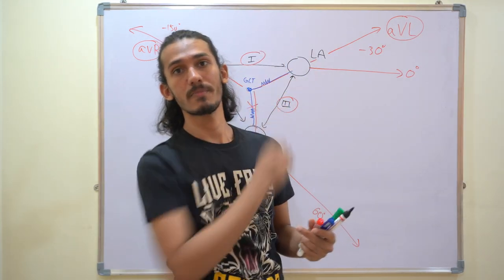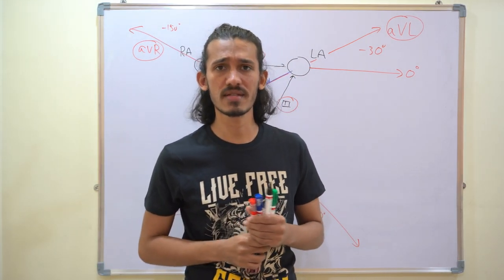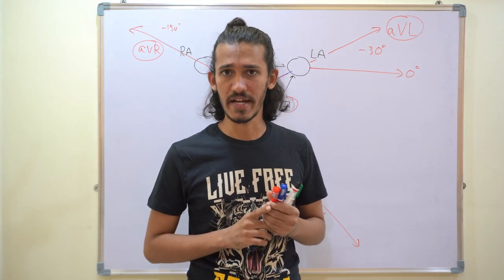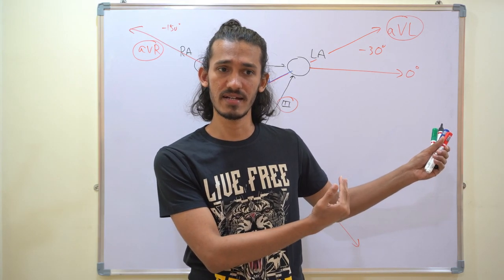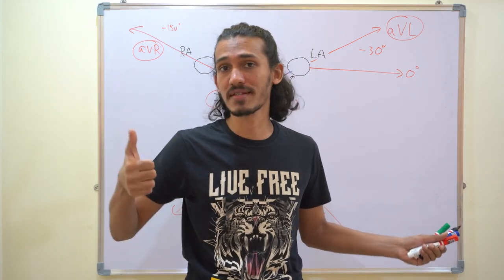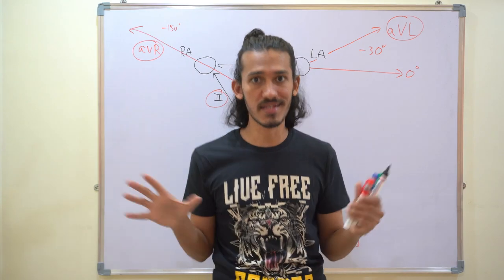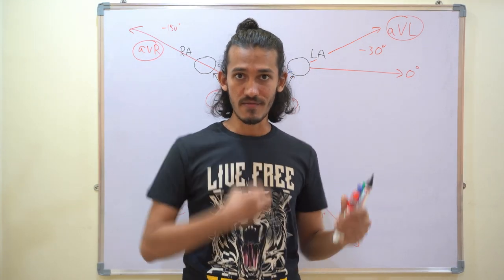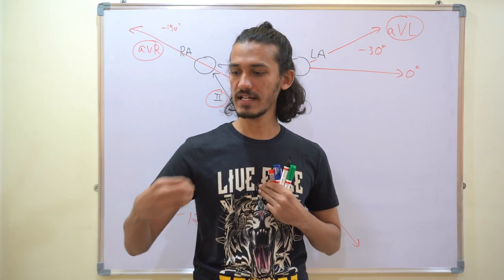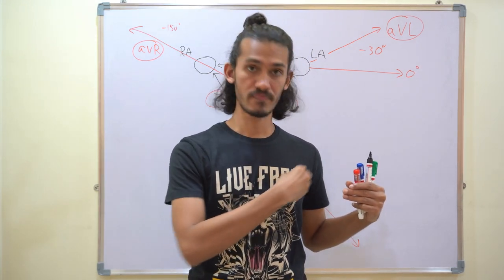V9 can go all the way to the back. So normally we don't need the posterior ones. What we usually use is still V6, right? So V5, V6, right? And we stop there. So these are the six extra electrodes. So the 6 plus 6 now becomes 12 electrodes that are there present. So what we understood here is there is a Wilson's central terminal. With respect to the Wilson's central terminal, we are taking different points here, like this, the chest wall, right?